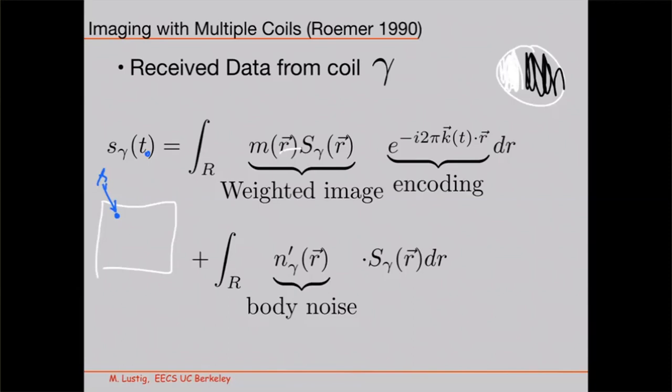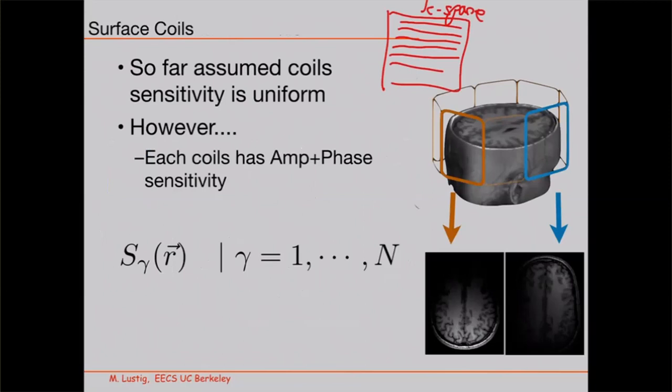If you can imagine, look at here. This coil observes this volume, and this coil also observes parts of this volume too. Let's pick this green coil over here and the red coil over here. They have some overlap in what they see. So obviously, even the noise that they pick up might be correlated. The other thing is they might also be coupled.